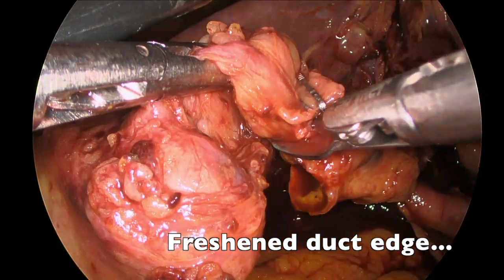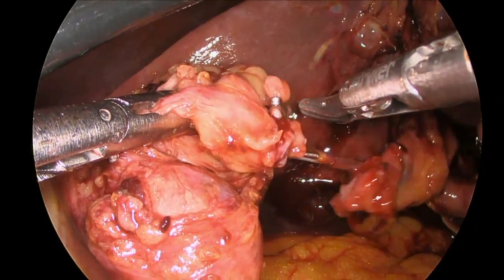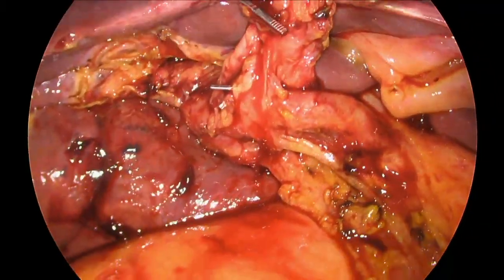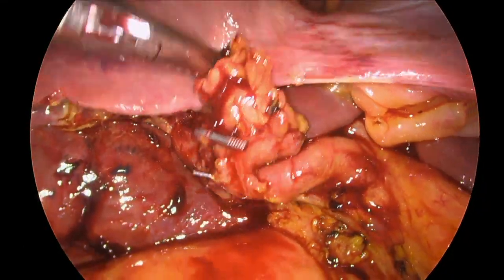You can see nice healthy bleeding edges, and we also use this as an opportunity to remove the gallbladder, thus creating more room as well. Again, the clear arterial anatomy and extra hepatic biliary anatomy with no accessory ducts is confirmed.